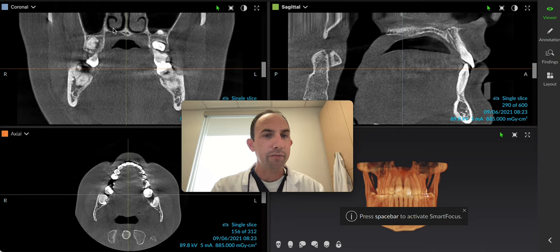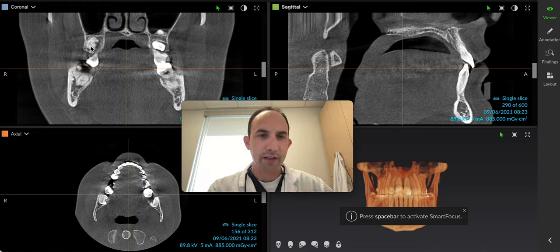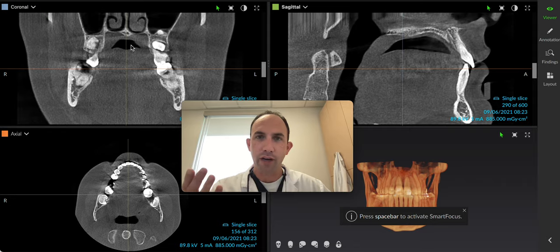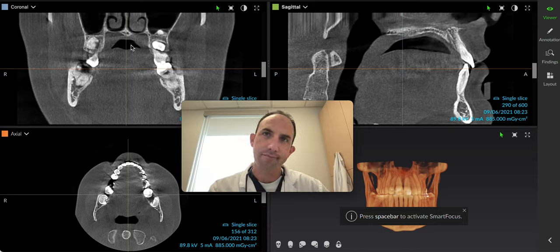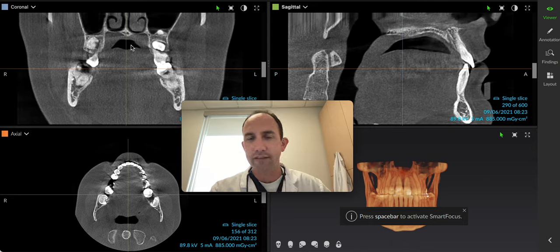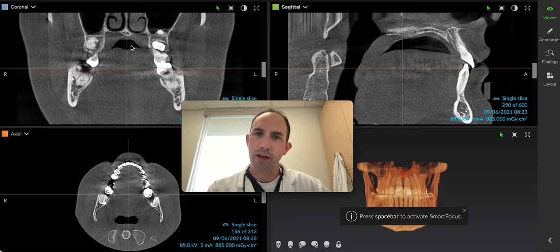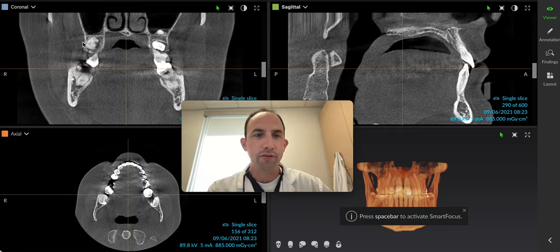Here you see a patient from five minutes ago — she's actually still in the chair right now — who came in because she wants to get her wisdom teeth out. As a matter of routine practice, we normally need a panoramic-type X-ray that's less than six months old. So the assistant asked me, should I take a panoramic or should I take a 3D? And I said, let's take a 3D, because we can create a panoramic from a 3D. So this is what we see.